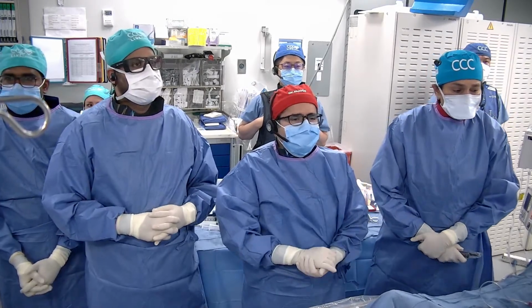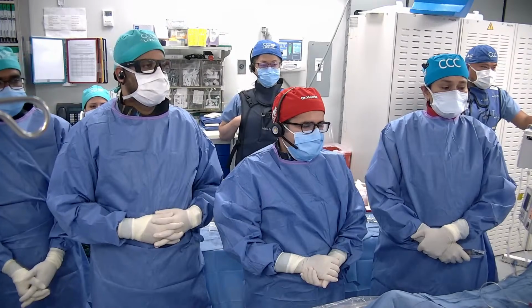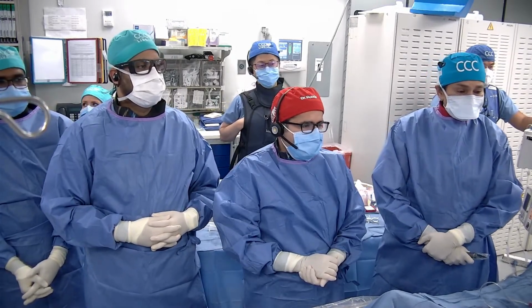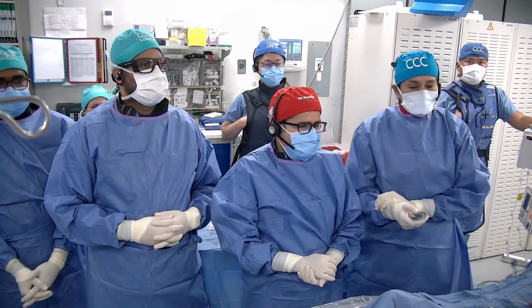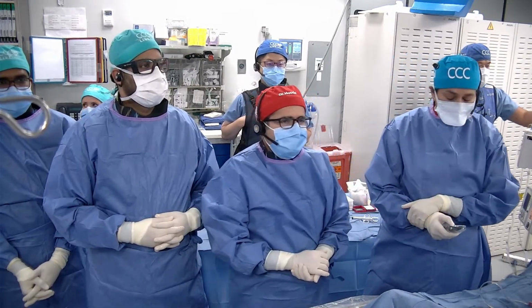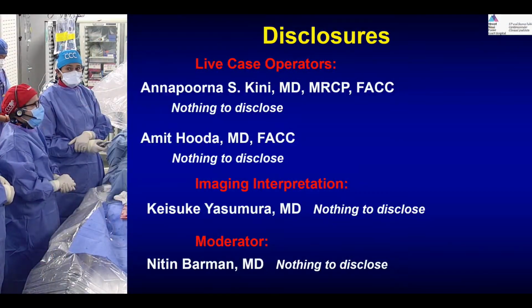And of course, we have Kiski, who will be leading our imaging part with the OCT. Techs are Asif and Hakim, and of course, nurses Will and Halina, who have been helping us during our live cases all the time. So going back to the slides.